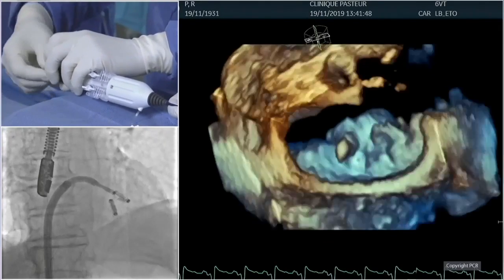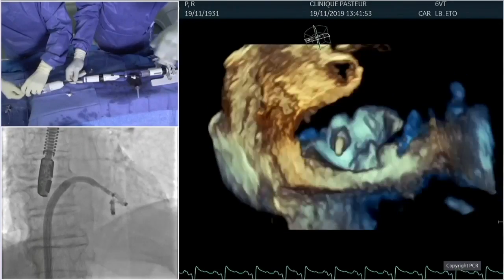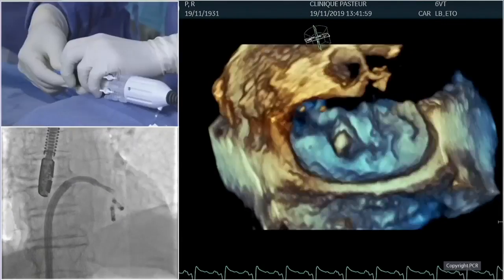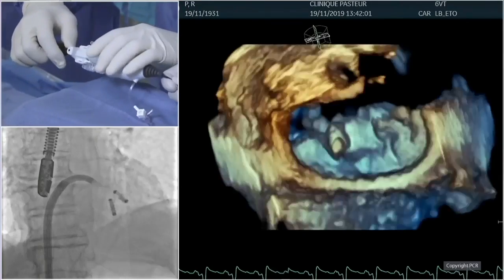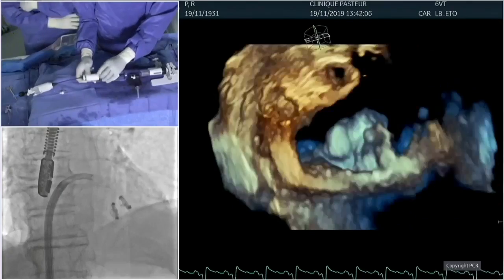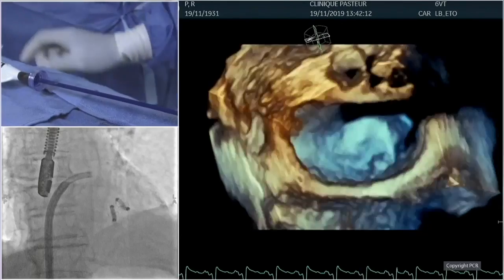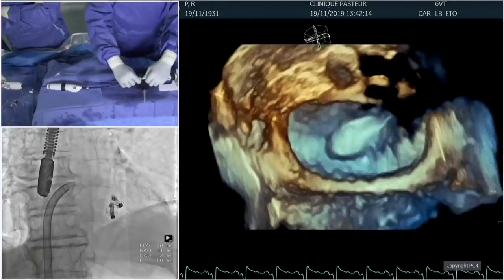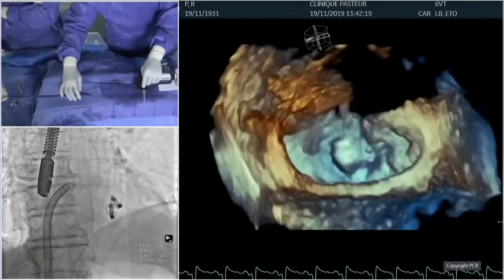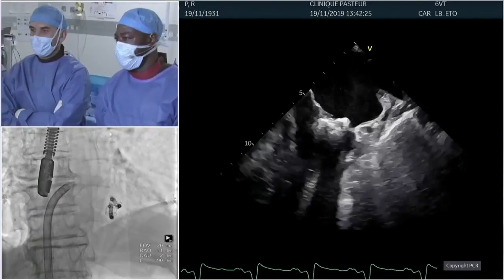The thing that you have to change is the plane, to be really parallel to the flex plane and to make sure you are parallel to the mitral plane. This is achieved by rotating the guide sheath clockwise or counterclockwise to make sure that you have that parallelism. I think, Jeff, in this case, one of the difficulties was that it was an acute flail and therefore not a massively dilated left atrium, with a very narrow AP dimension, from aorta to posterior. Getting it positioned correctly when it's that narrow is pretty tough.